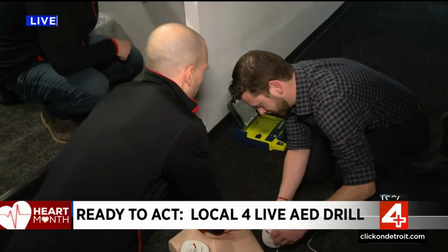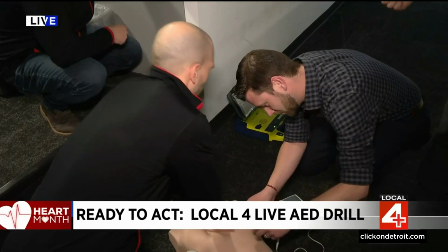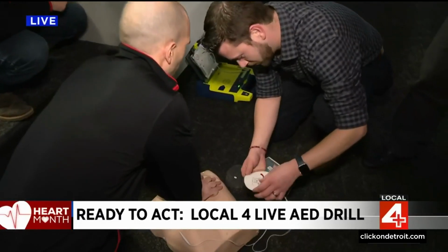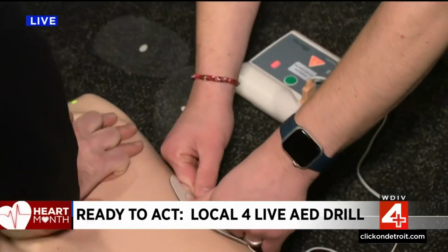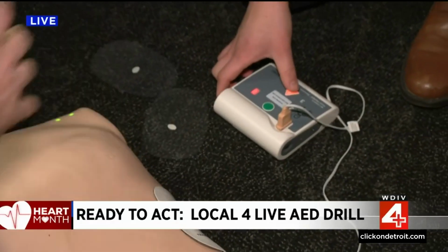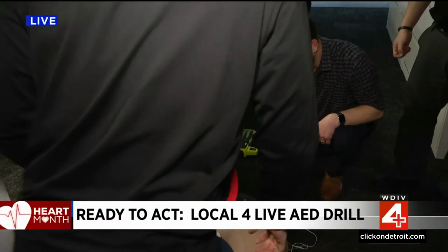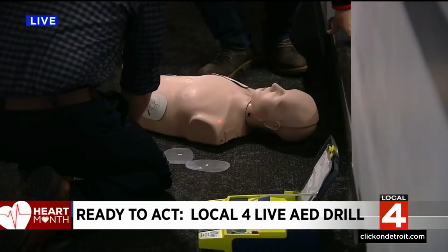Next, separate one of the white pads completely from blue plastic liner. Make sure you're listening to the AED. I know we got two different ones going. Next, separate one of the white pads completely from blue plastic liner. Begin peeling from the tabbed corner. Deliver shock now. Shock. Next, separate one of the white pads completely from blue plastic liner. Begin peeling from the tabbed corner.